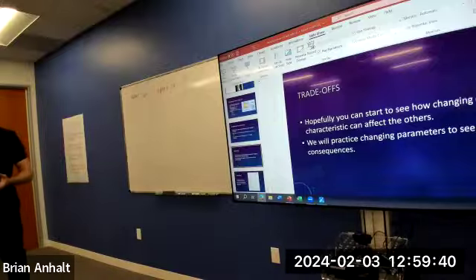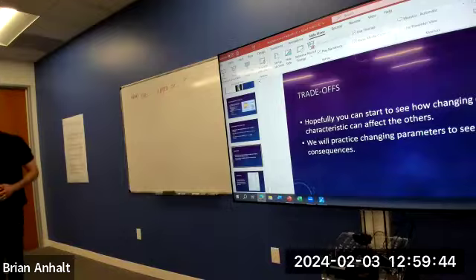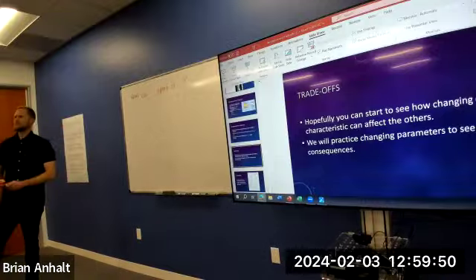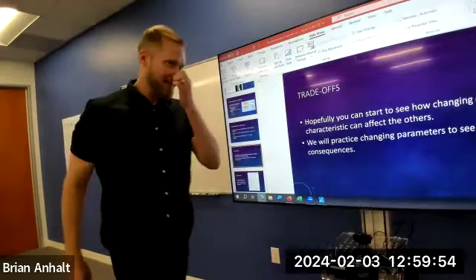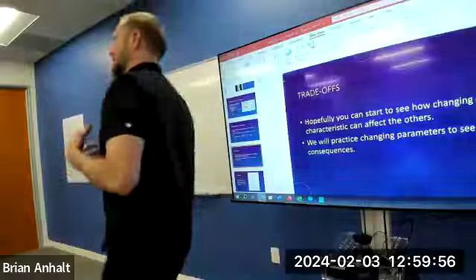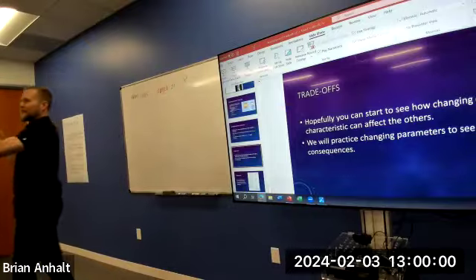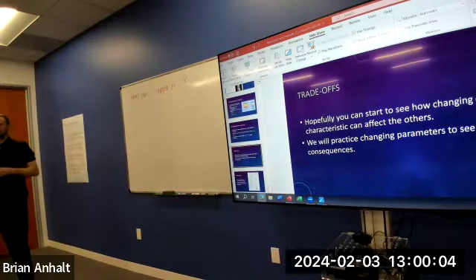Fuzzy means we don't have enough resolution. Blurry, fuzzy, they mean the same thing. Don't worry, I put in the test, low resolution. What do I need to do? Increase resolution. I don't care about SNR. I just want to get better resolution.